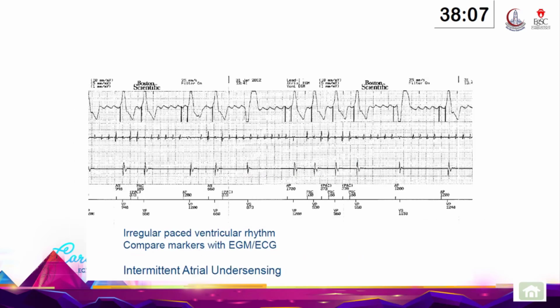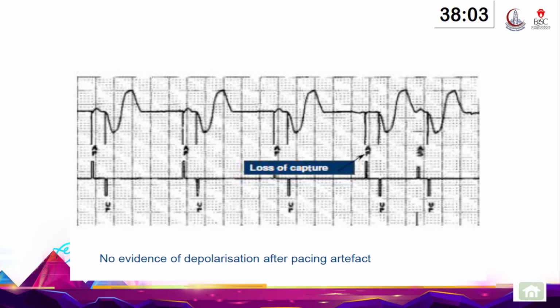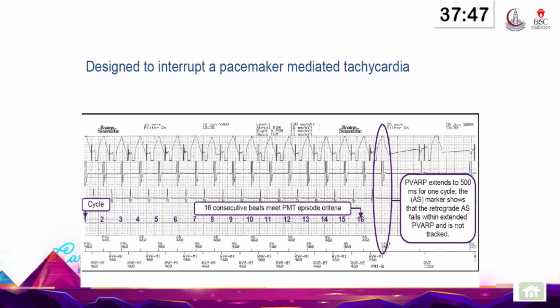We will not talk about loss of capture and its causes, the reasons behind loss of capture that can be physiological, clinical, pathological, or even technical due to different reasons. Even the PMT prevention and the different algorithms that avoid PMT or work on PMT resolution, we will not be tackling, because most of the PMT algorithms are the same. Boston, Medtronic, Abbott have the same concept, same feature, and same steps. However, we will be talking about something very specific to Boston Scientific. The name, you know it from different manufacturers as well, but the feature itself and the stages are completely different.